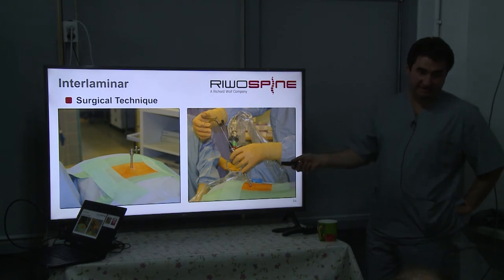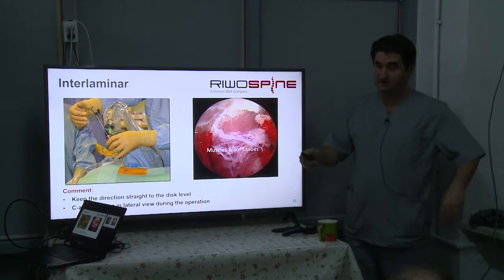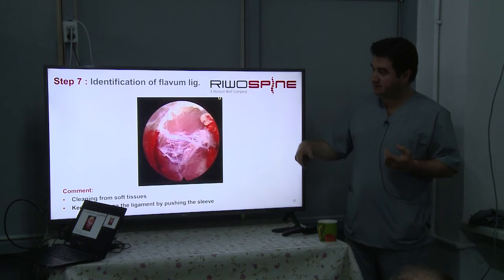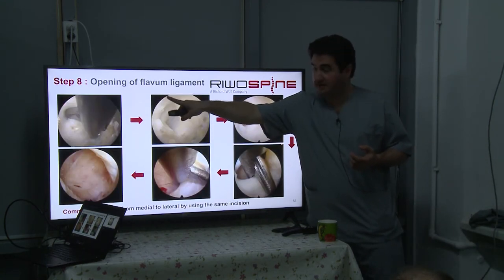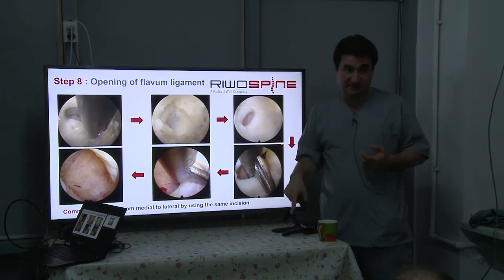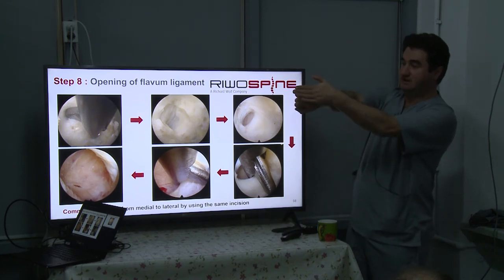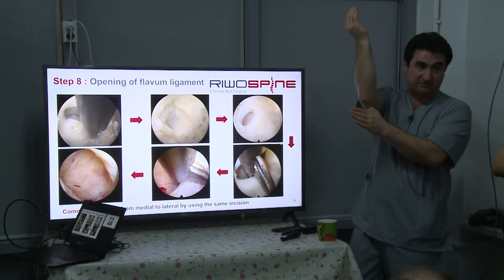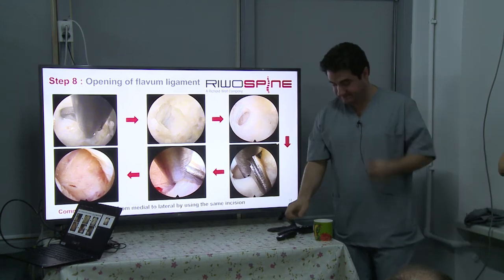The approach is really easy here. The first step, you see the muscles, and we clean them, and then we find the flavum ligament. And then we find the flavum and try to open it from medial to lateral. Always medial to lateral, not lateral to medial. Because it's like that, and the roots are like that. If you open from here, maybe you can catch some part to open the medial. But you can come from medial to lateral like this.